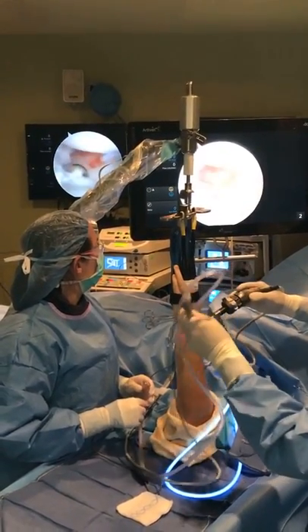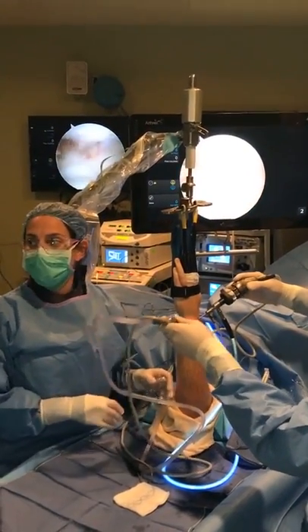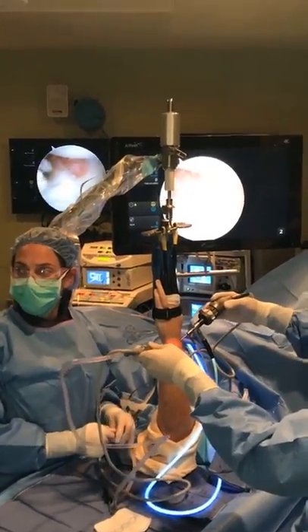I'm pretty sure this is a peripheral tear. You want a fast fix? Yeah, I have the fast fix ready. Get the fast fix ready.